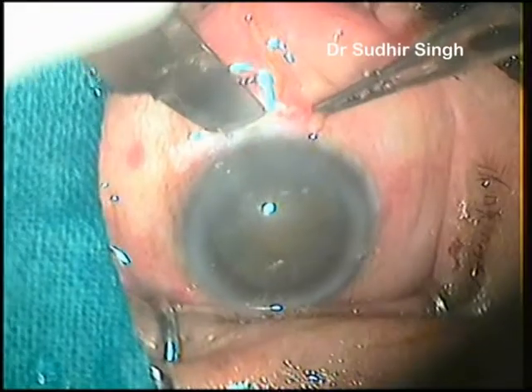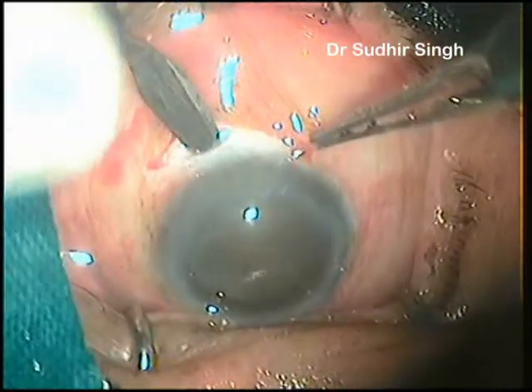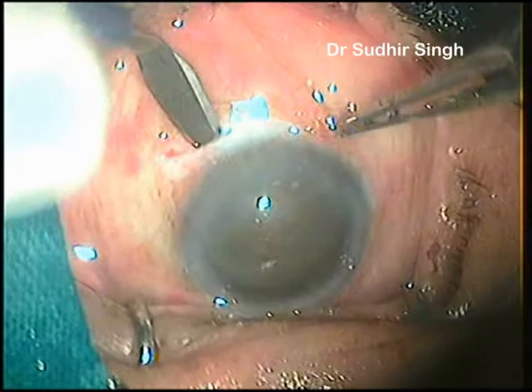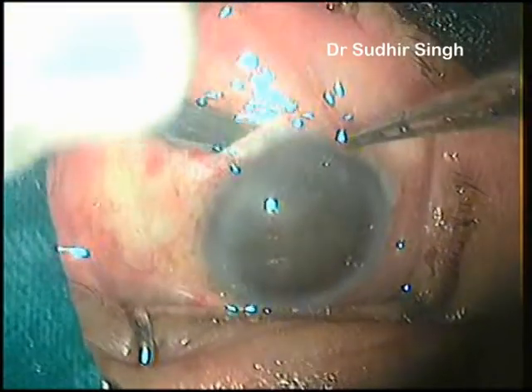A seven mm frown-shaped incision is made with a number 15 Bard-Parker knife, 1 mm away from the limbus. A self-sealing sclerocorneal tunnel is made with a crescent knife.